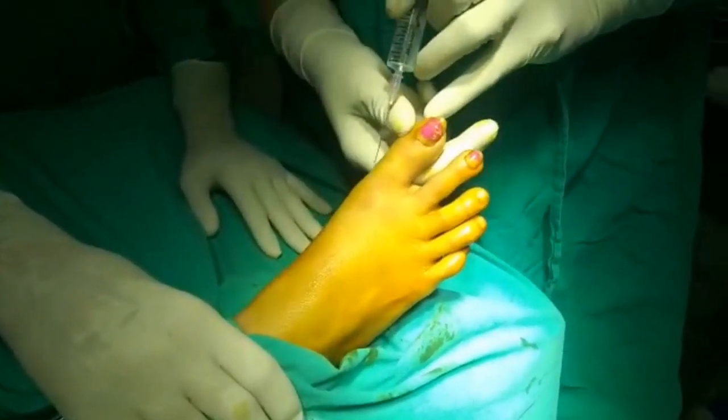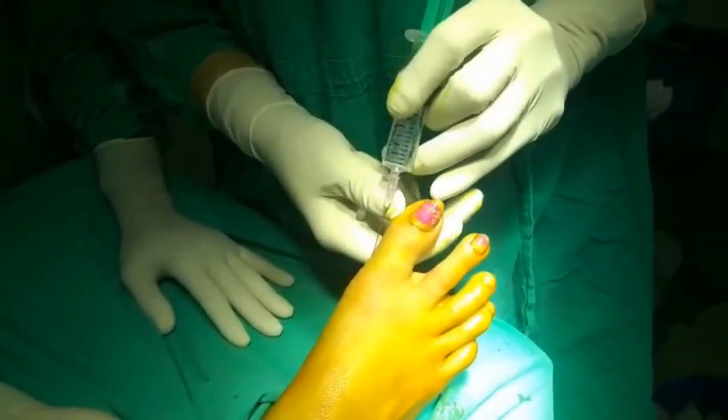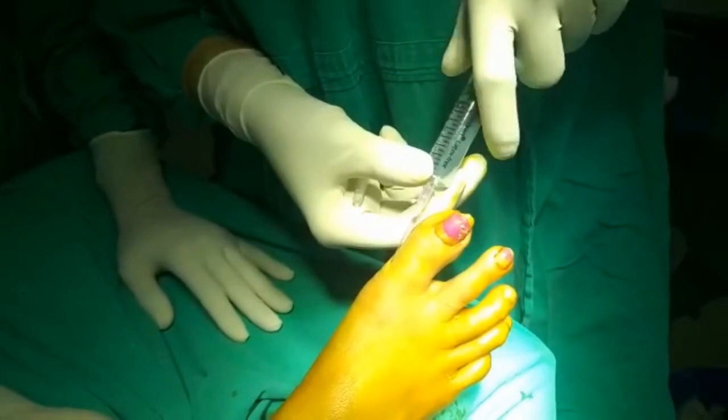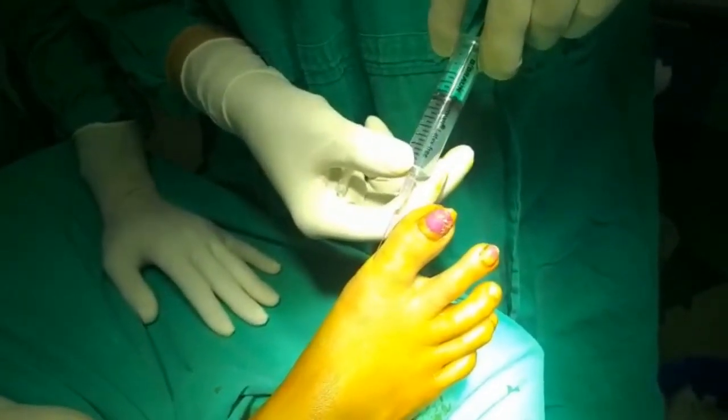Now we enter the medial aspect. Watch for the color change of the skin from the dorsal to the ventral aspect. Aspirate and inject.